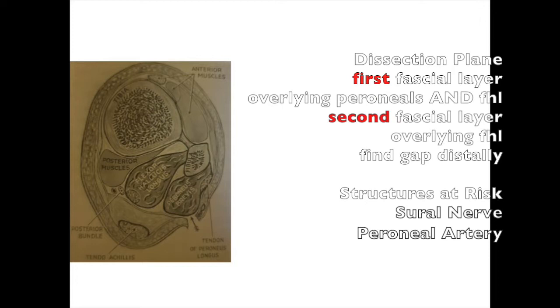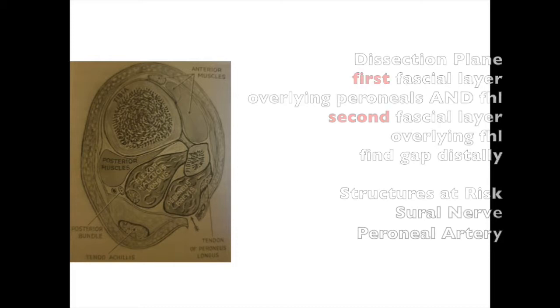The approach involves going through two fascial planes. The first one will expose the peroneal tendons, and then you need to retract the peroneals anteriorly and you'll see a second fascial plane over the FHL. If you divide this, you'll be able to find a gap between the peroneals and the FHL distally. Watch out for the sural nerve.